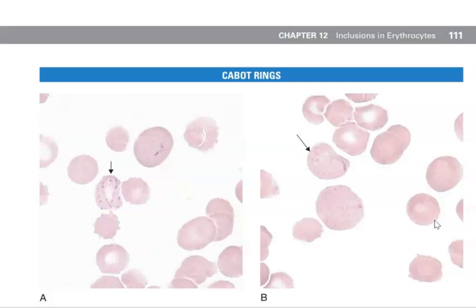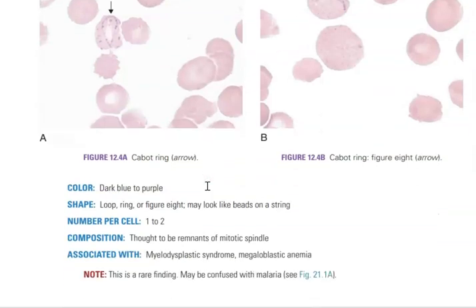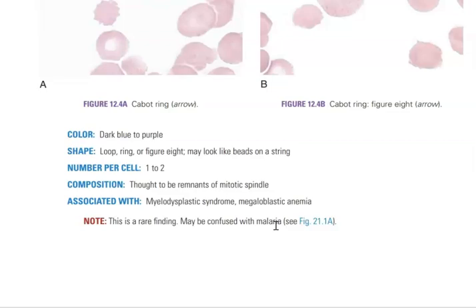Next up on page 111 is our Cabot rings. Cabot rings are thought to be remnants of the mitotic spindle. Remember, the mitotic spindle helps our cells divide, and these are kind of a rare finding. The Cabot rings are these fine, spindly little rings that you find. Sometimes you can find them in figure 8 patterns, but these are not found very often. They're a rare find, but again, they're thought to be a remnant of the mitotic spindle.